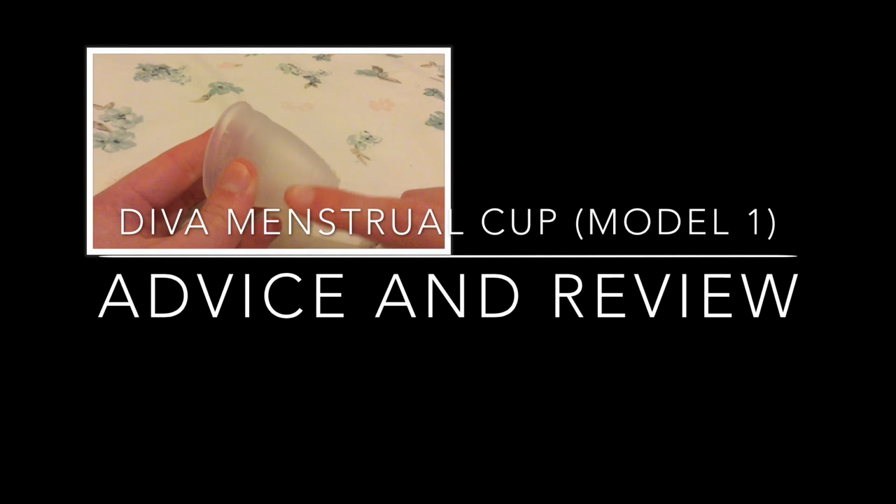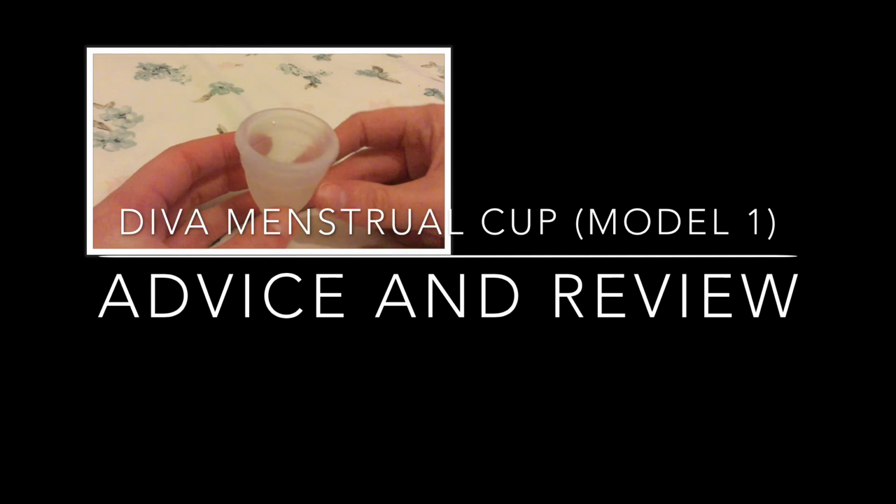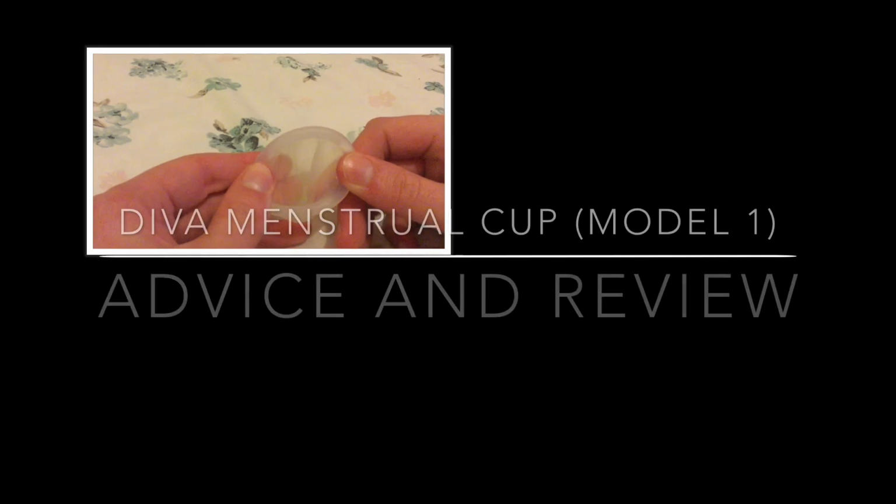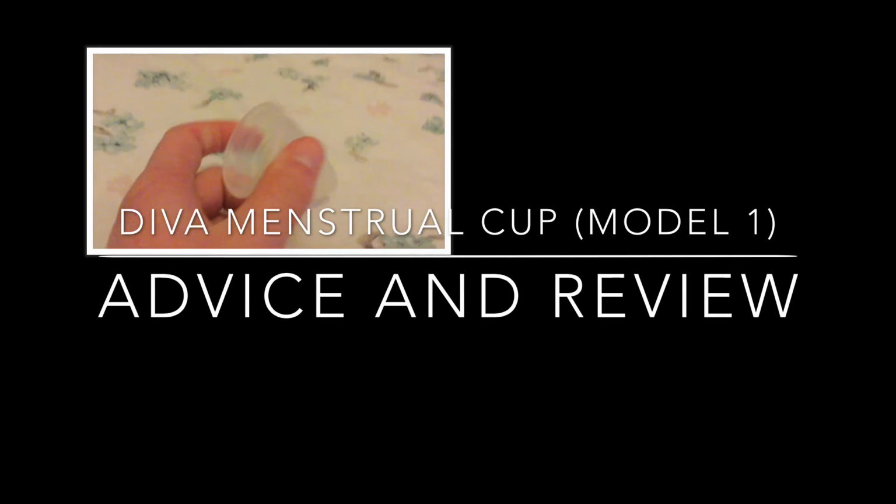Also, to be quite honest, although this may sound a bit ugh, you will hear a strange sound when inserting and also removing the cup, and this sound lets you know if the cup is in and unfolded completely. If you don't hear this weird suction sound, then your cup has not fully unfolded, and like I said, you need to take it out and start again.